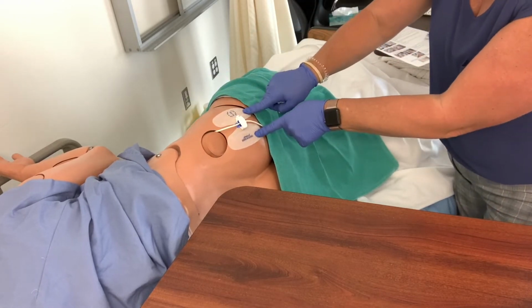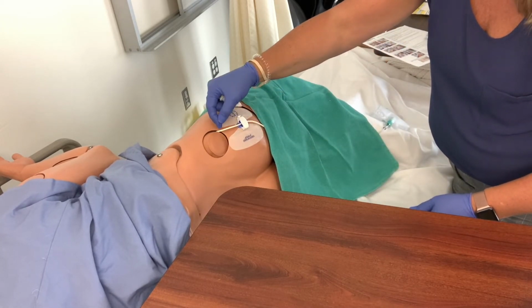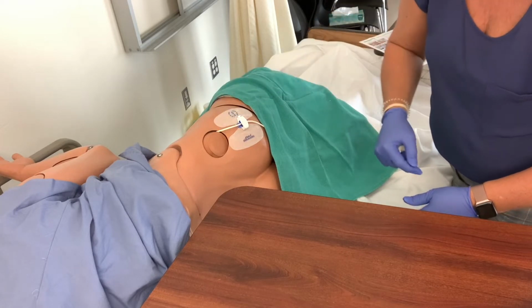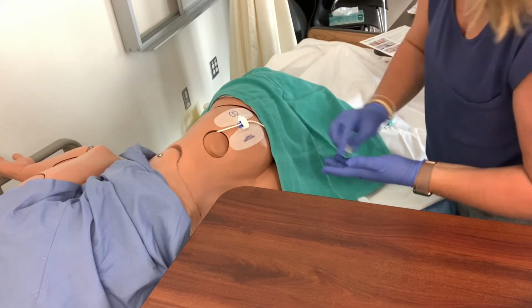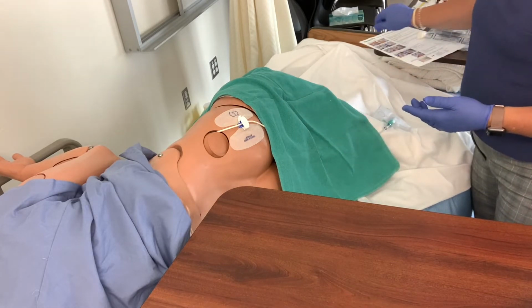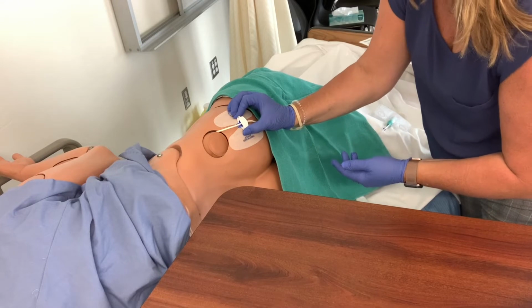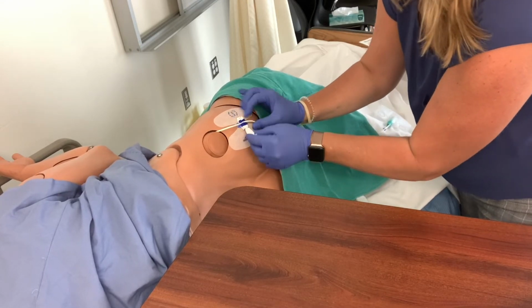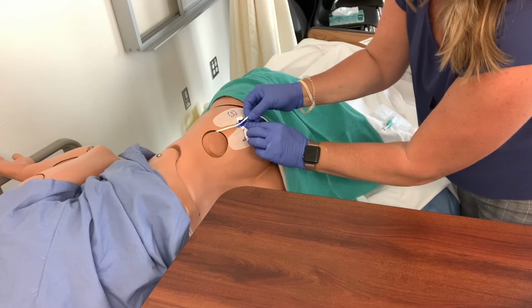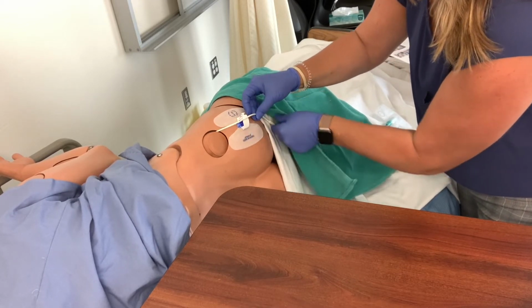It is held in by a stat lock. It should be okay, but I don't want any pull or any tension on the insertion site. The dressing is just like a big Band-Aid over top. I'm going to remove that, and now I'm going to get rid of the stat lock. I'm going to pinch it to release, very similar to the catheter one, and then I'm going to take the catheter out. I'm just going to set the catheter down.